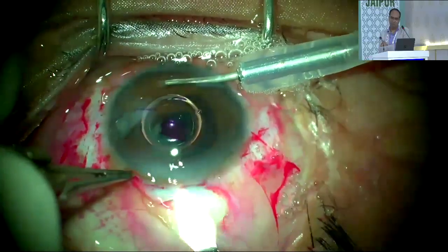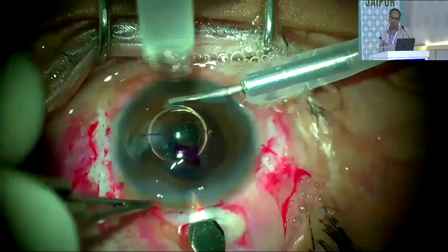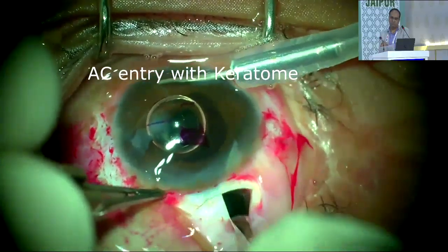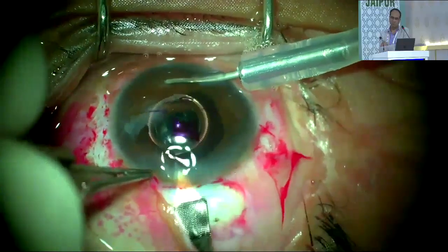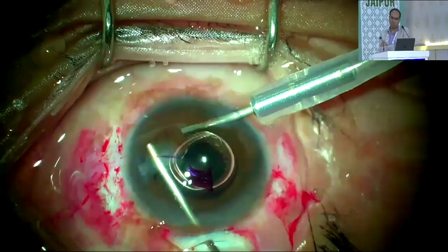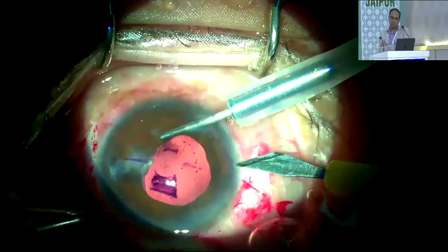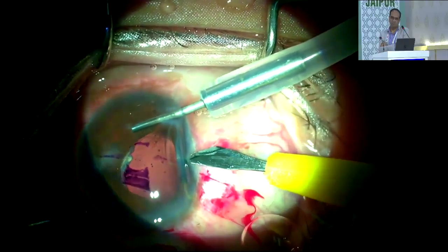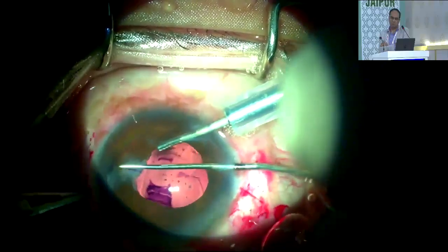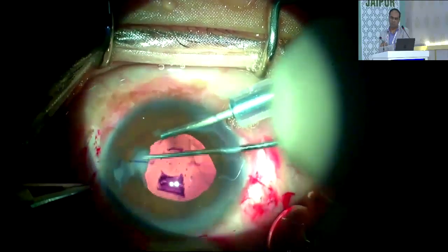This is followed by a 2.8 mm keratome entry into the anterior chamber and the incision is enlarged. Then a side port entry is made at the 9 o'clock position using a lance tip. The iridocorneal synechiae are broken using a Sinskey hook.